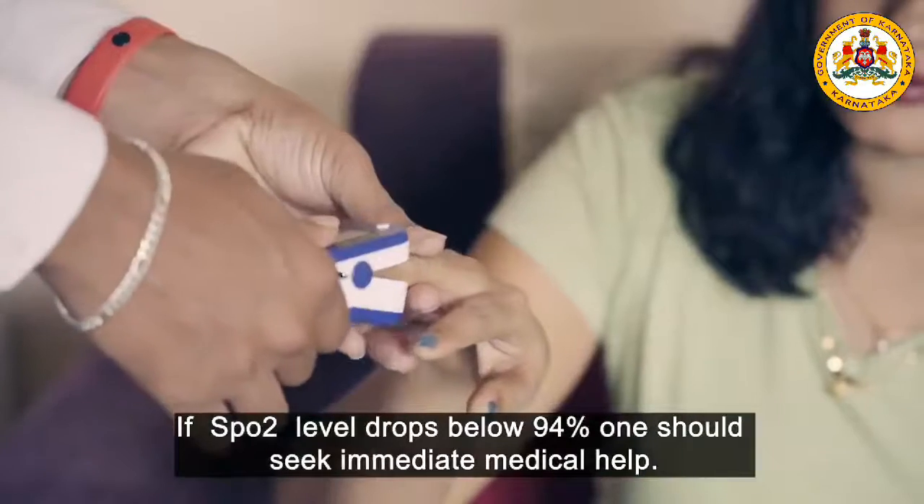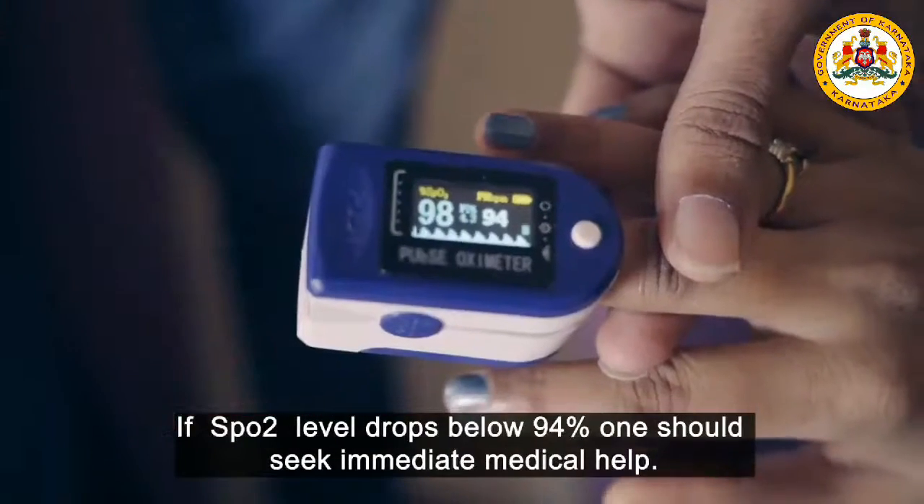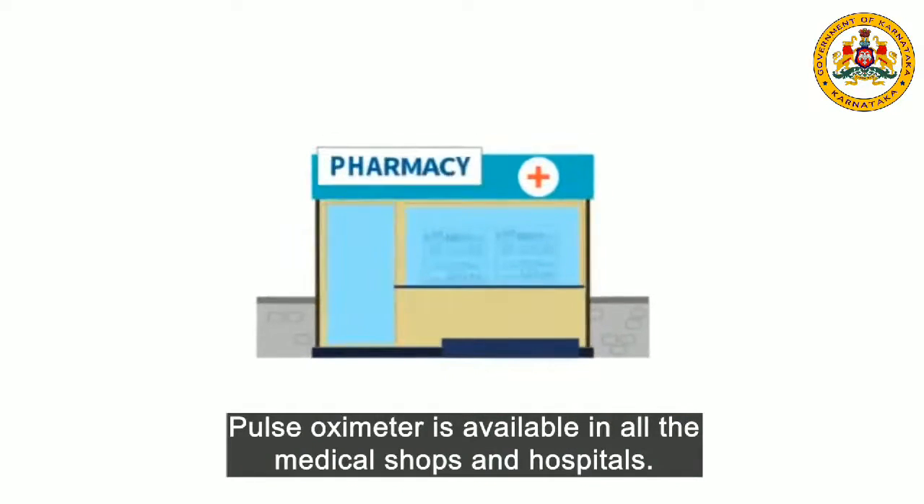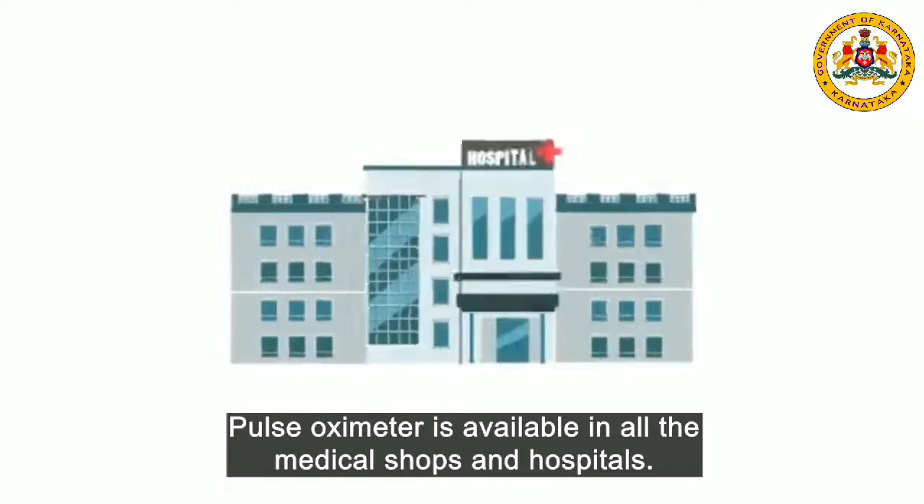If the SpO2 level drops below 94%, one should seek immediate medical help. Pulse oximeters are available in all medical shops and hospitals.